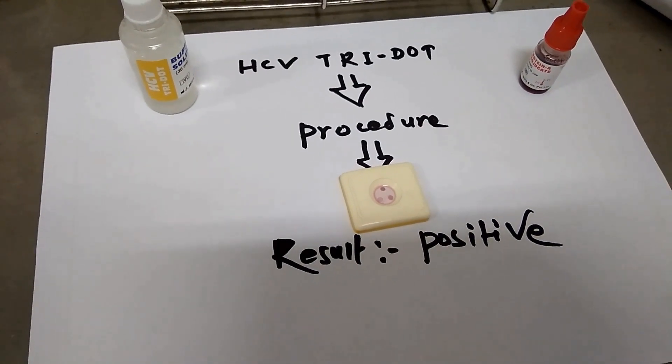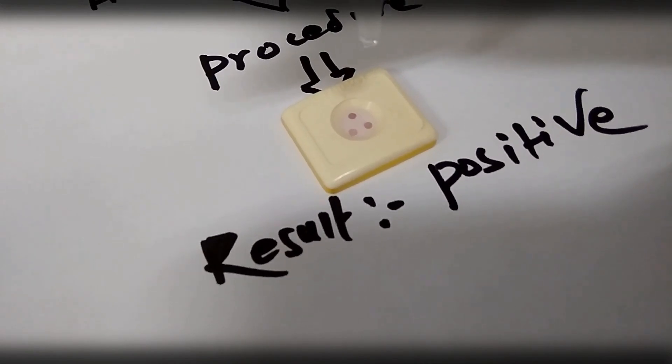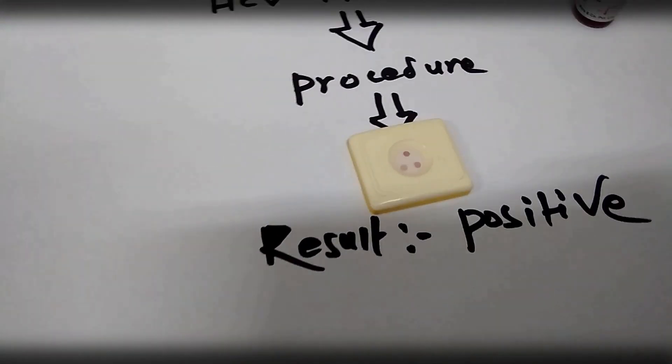Finally add 5 drops buffer and after drying, interpret the result.